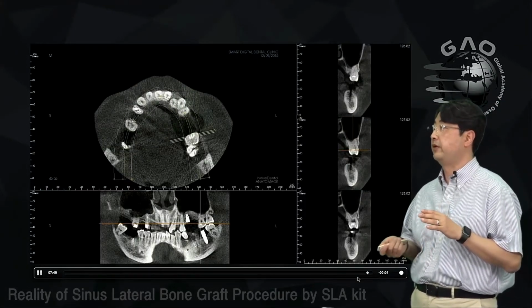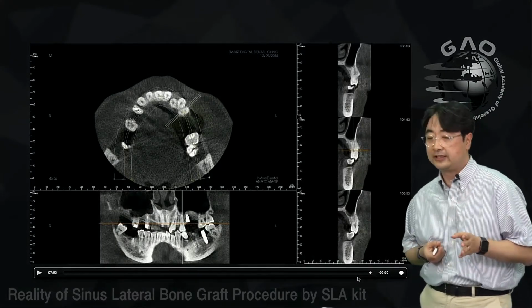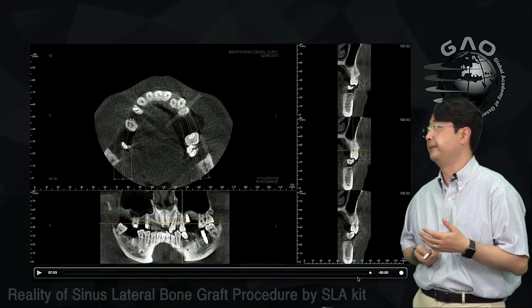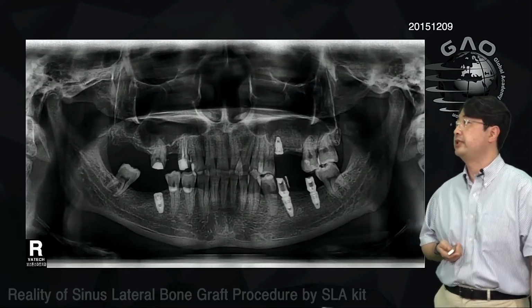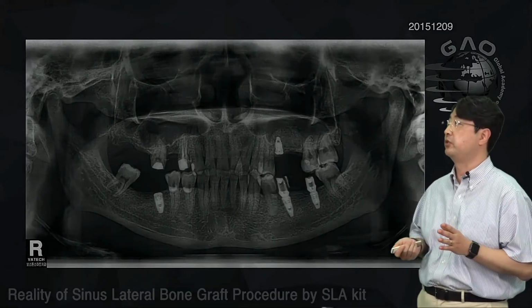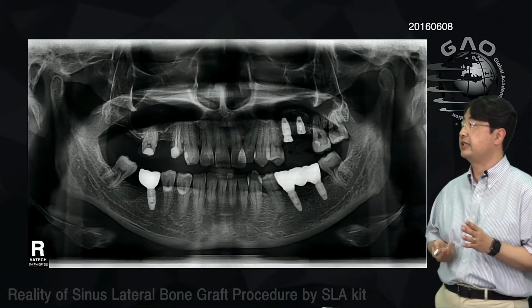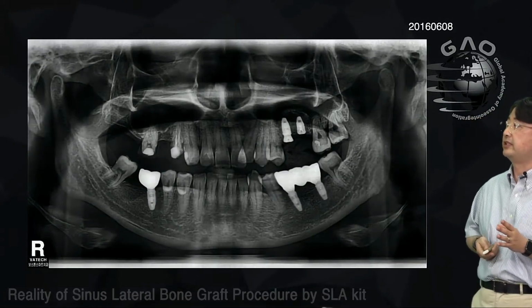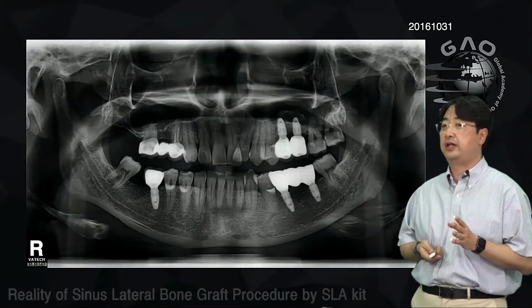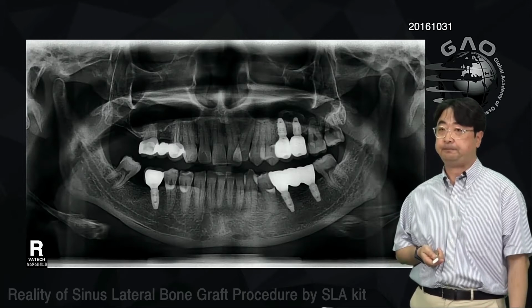You see the bone filled around the implant. So I decided not to place implant number 26; I'm going to place it later on. Okay, so this is immediately after the sinus graft and implant placement on number 25, right? Then after 6 months, I placed number 26. This is how it looked. I waited for a while and I finished the restoration for this patient.